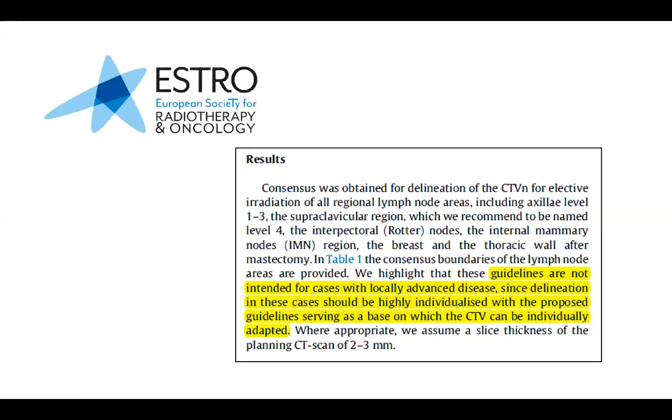And what we usually practice is a combination of both the guidelines, I think, because we don't stick to any single type of guideline. Yes, ma'am. So I think it's both, and then we do it according to our convenience. Yes, ma'am.